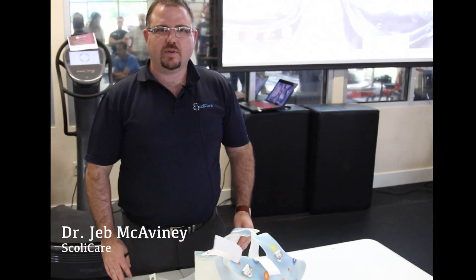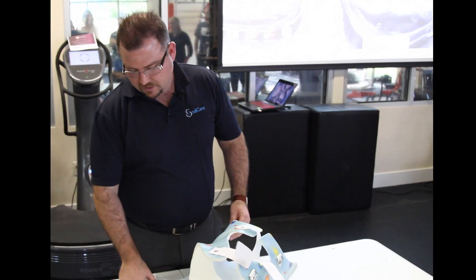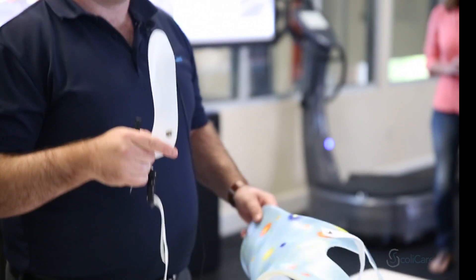Hi, my name is Dr. Jeb McAviney from ScoliCare. Today I'm going to show you how to fit the kyphosis arm, which we have here, to the hyperkyphosis brace.